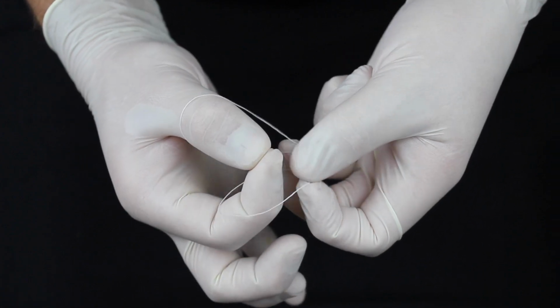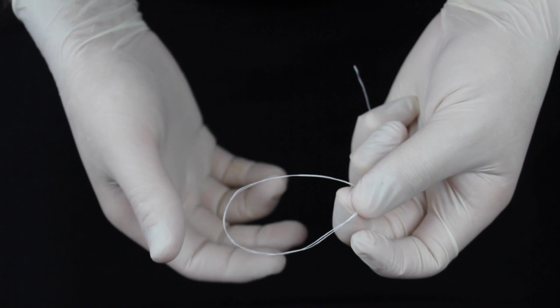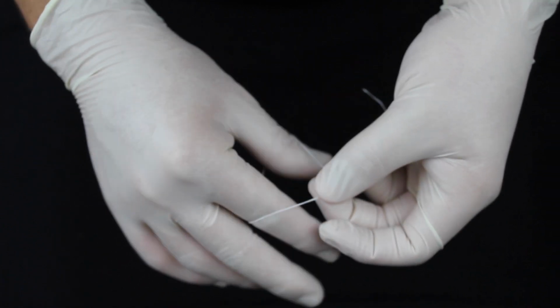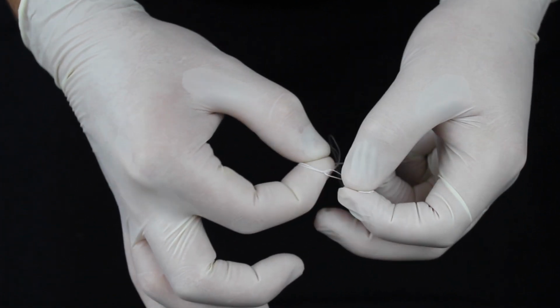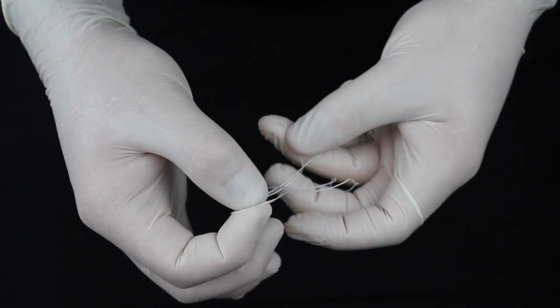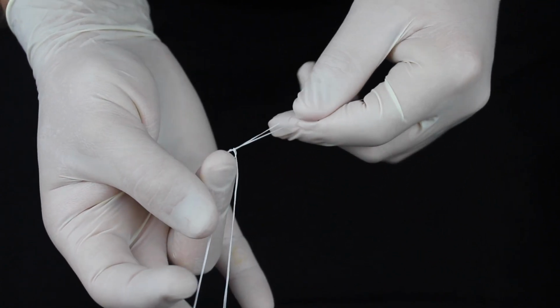You proceed by placing your index finger and thumb through the loop and pinch around both ends of the floss. You now have a double loop, but you need to repeat the same motion again. Now you've got a secure double loop.